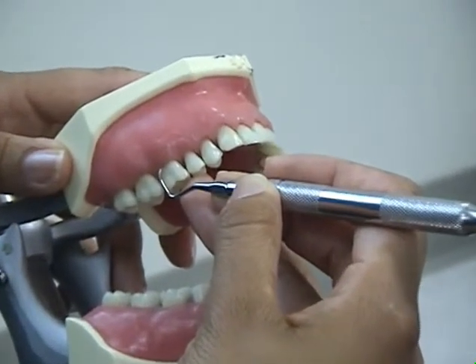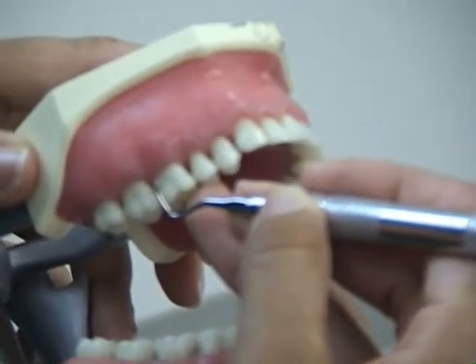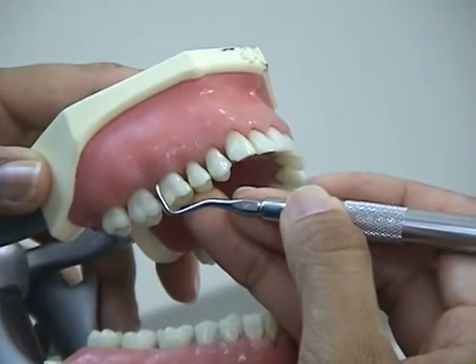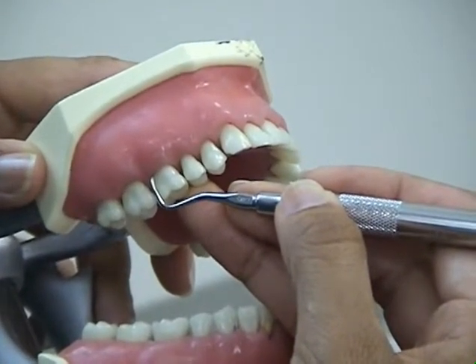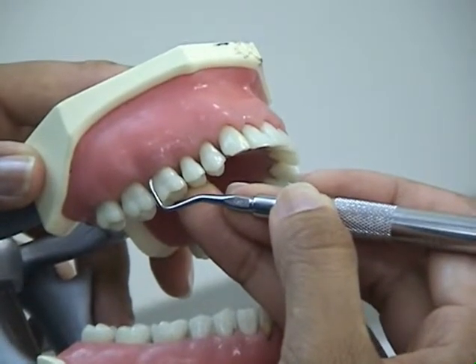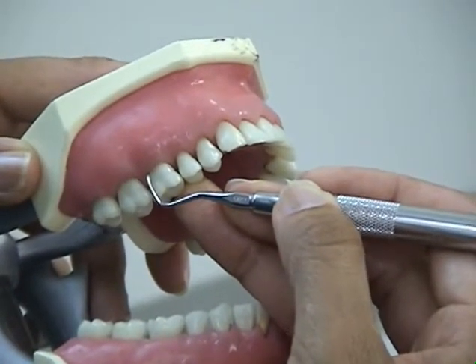For insertion beneath the gingival margin into the sulcus or pocket, the working end is inserted with a closed angulation of 0 to 40 degrees. Position the working end with the toe pointed toward the gingival margin. Keeping the face as close to the tooth surface as possible, slide the toe beneath the gingival margin.